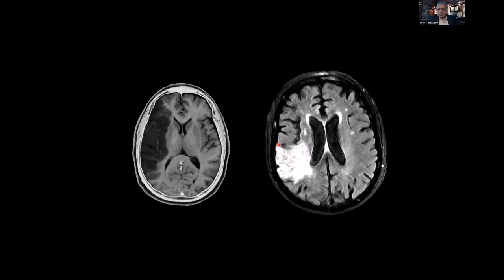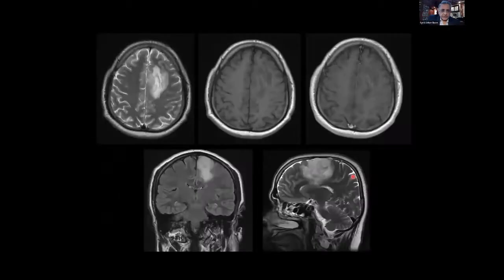And this just shows an image where you have an infarct over here. It's hypointense, whereas the infarct in a FLAIR is hyperintense. And this is a FLAIR because if you notice, there's white around this subependymal area. Okay, all right, moving on.